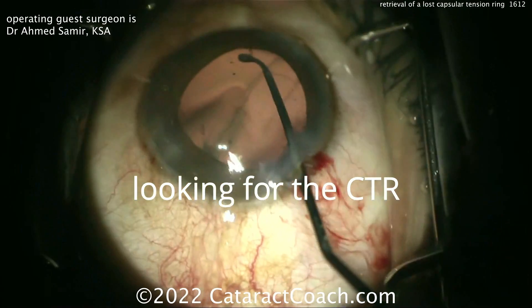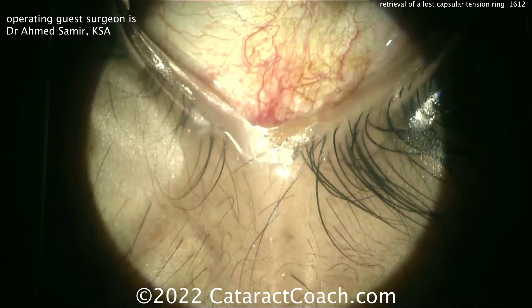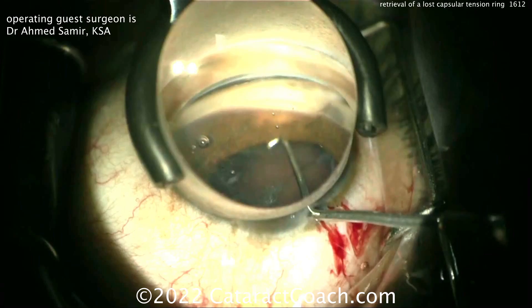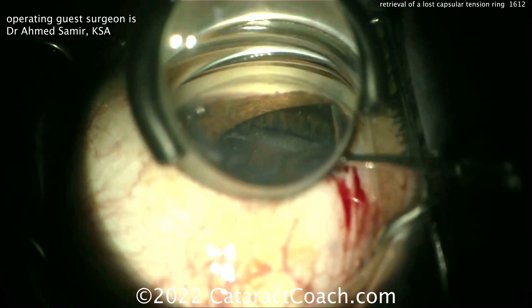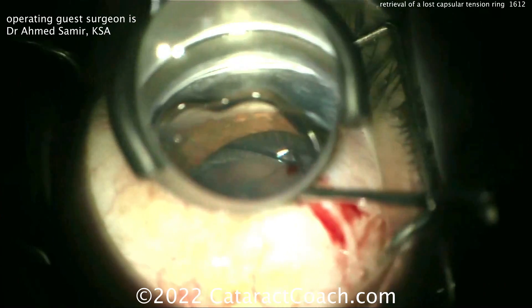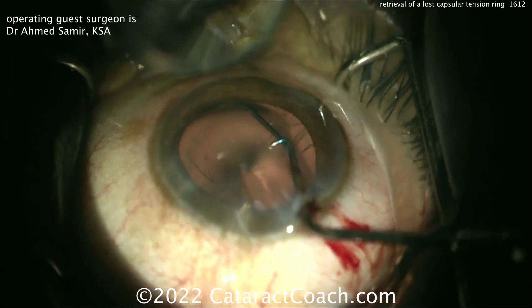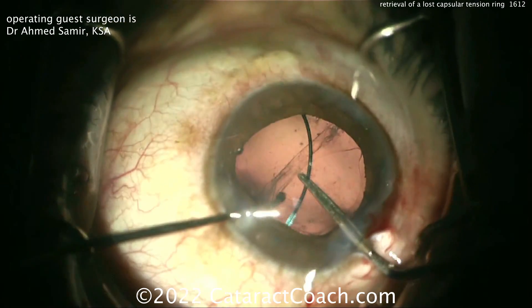We put a CTR in, so the surgeon is looking for it — where has it gone? This is so stressful. Now the surgeon is going to do something very smart: pushing the head away and placing a gonio prism on the eye to look in the angle. Can you find the CTR? Yes. The CTR was placed above the capsular rim — it was placed erroneously in the sulcus. Using a hook there to grab the CTR and pull it centrally. That gonio prism was magic.